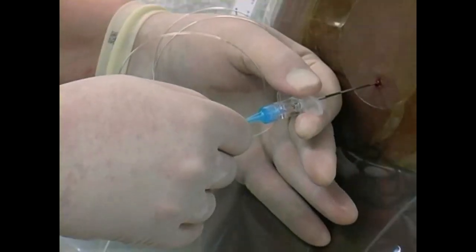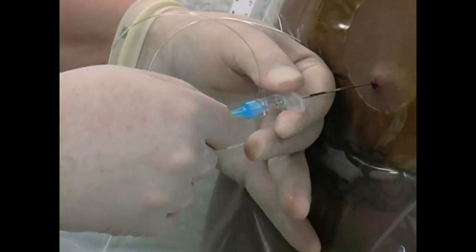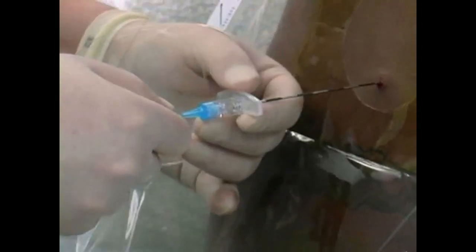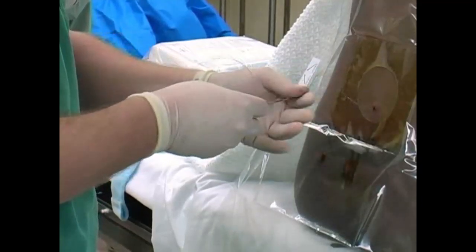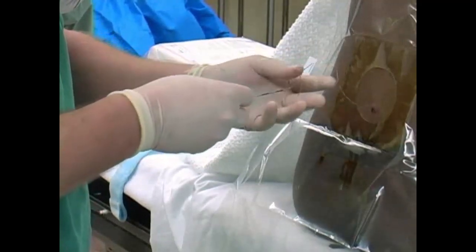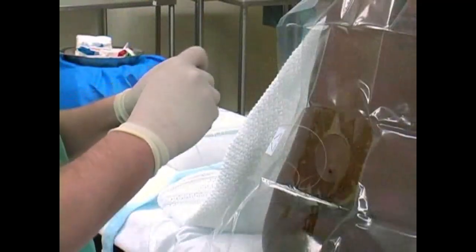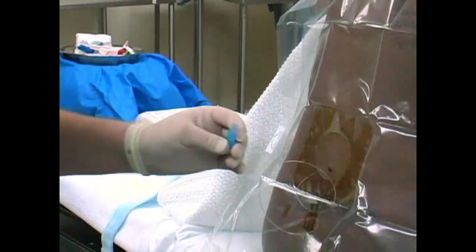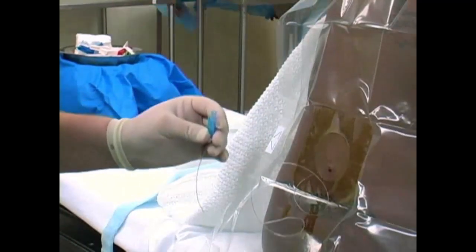After the epidural has been correctly placed, carefully withdraw the Tuohy needle while holding the catheter in place. Continue to withdraw the needle over the catheter. Insert the exposed end of the catheter into the lower connector and snap the connector closed to prevent contamination.